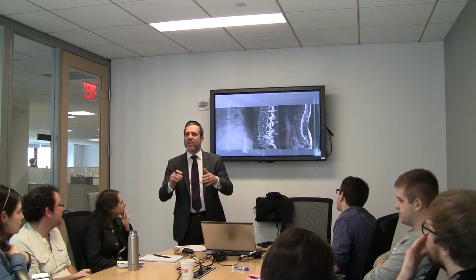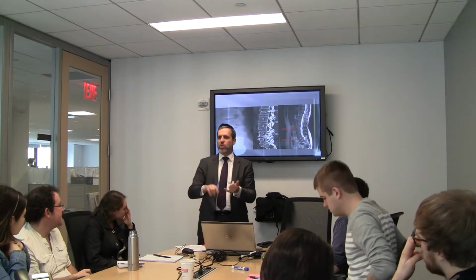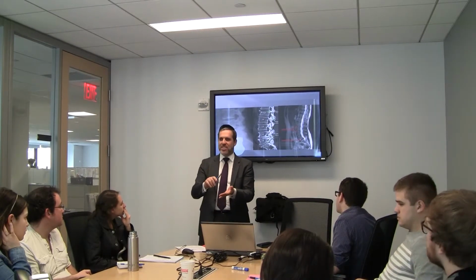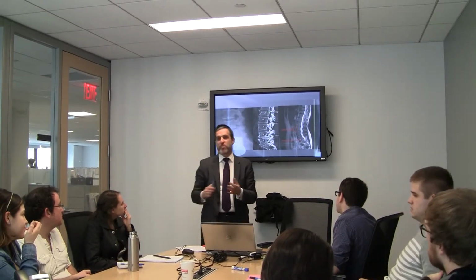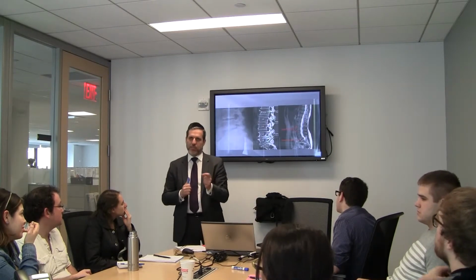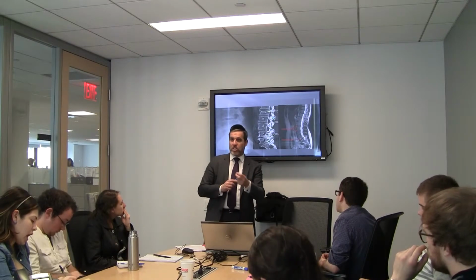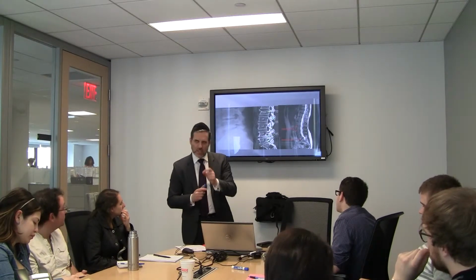So therefore, they're obligated to report on everything they see, the bone, the soft tissue, the fatty masses, the nerves, to the best of their ability. Now, a little bit of history helps, because then it tells them, if you're worried about a radiculopathy or a sciatica, then you're really looking at those discs a little bit more.